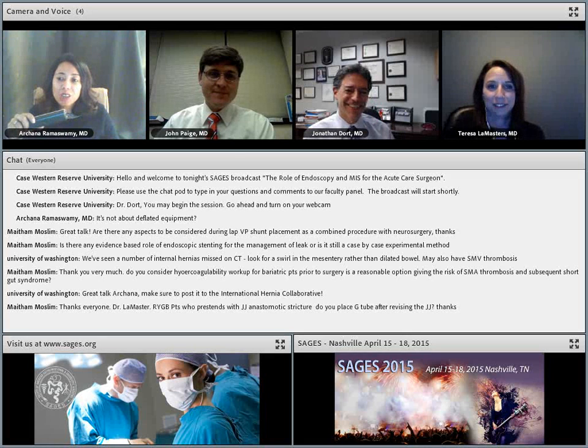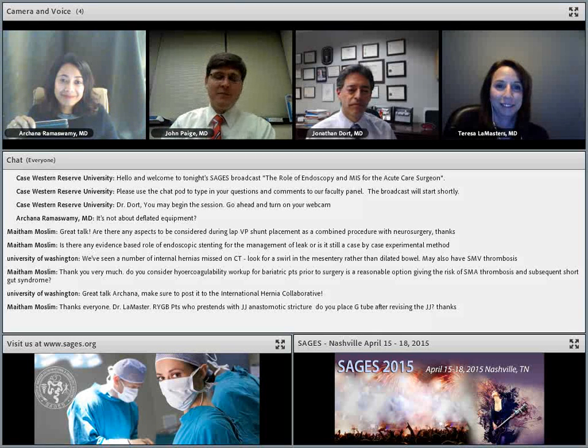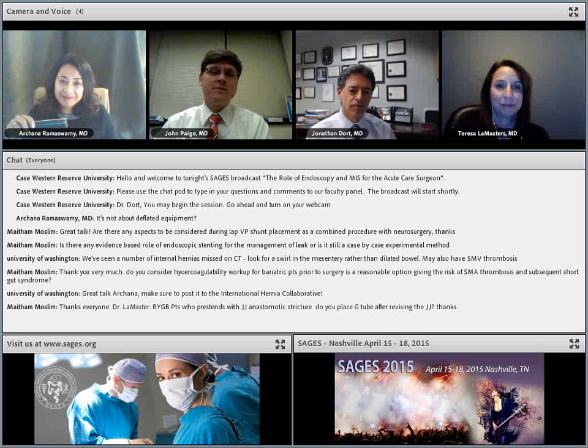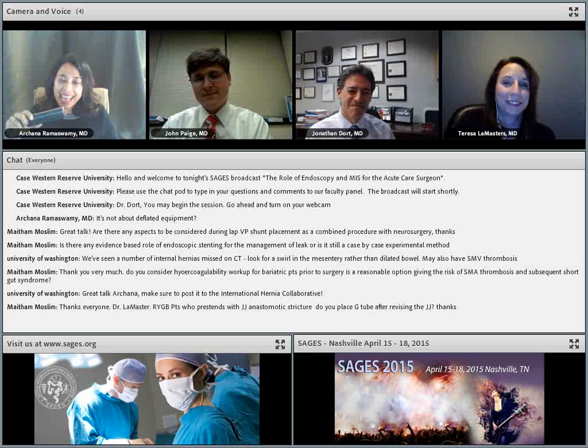How about all of you, do you close the 10-12 ports that have been placed with something like an XL trocar? I tend to close 10s and 12s, but in bariatrics, if you do it high in the abdomen, sometimes I'm not as worried about it. But typically, I tend to close 12 and 10. I never did. I always kept the 10-12s off the midline, especially in the bariatric population, and thought I was protected. And then you get one, and then you start doing it. So I converted. I had that one years ago and always closed after that.